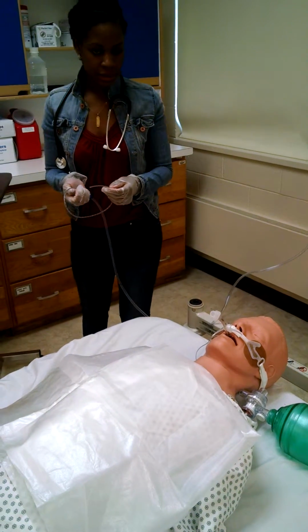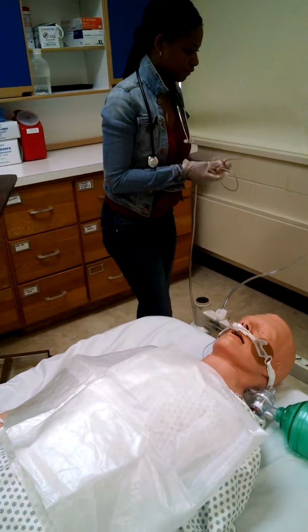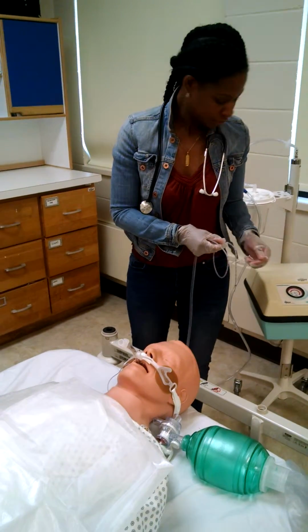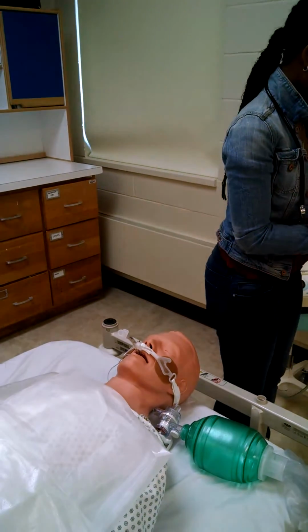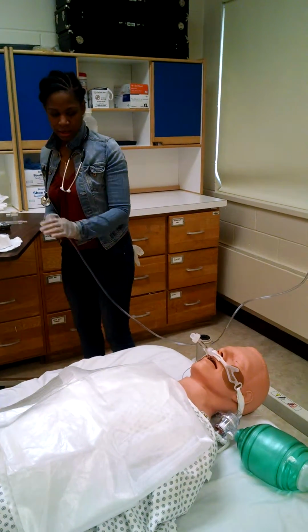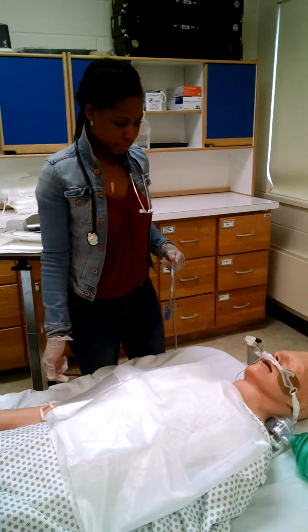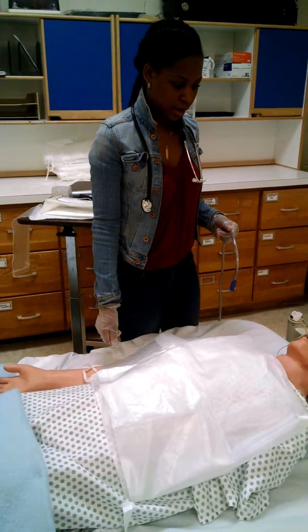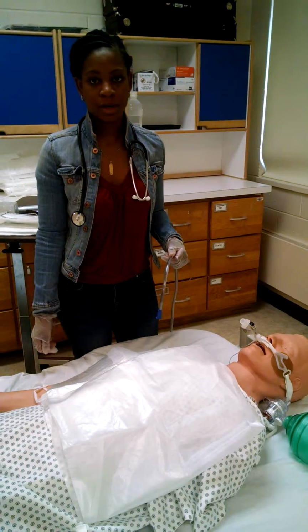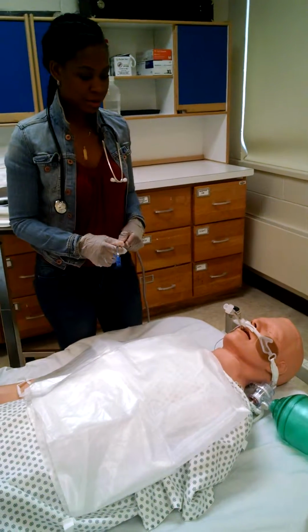Okay. Now that that's done, I'm going to go ahead and turn off my devices. And I would have checked the patient's pulse before doing an active procedure. Check for his sputum characteristics, and if he needed to be suctioned more, I would suction some more. And after the procedure, I'll wash my hands.